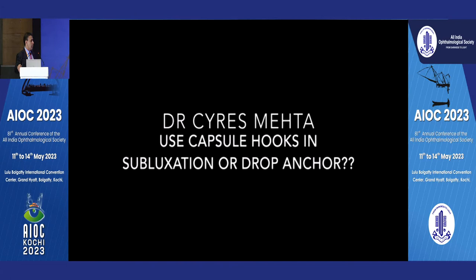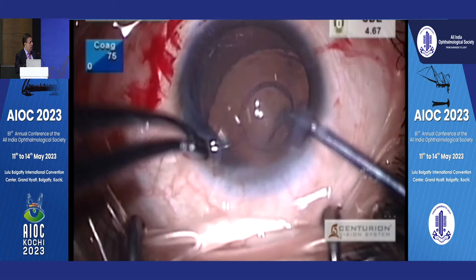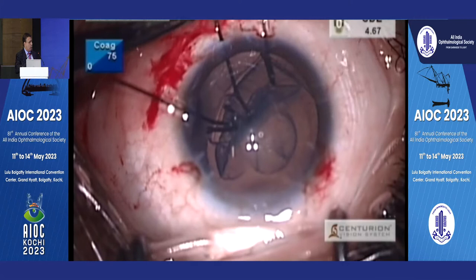This is the video I made for ASCRS and ESCRS three years ago — use capsule hooks in subluxation or drop anchor. This was pre-COVID. In a grossly subluxated case, if you have a femtosecond laser to help you, it makes a huge difference. Of course you can do a rhexis manually, but you will never get this perfect punched-out four to five millimeter rhexis like this — it's absolutely impossible to do by hand.